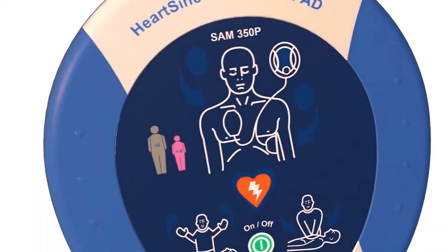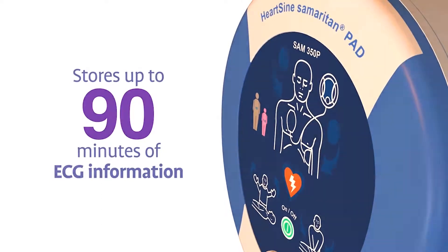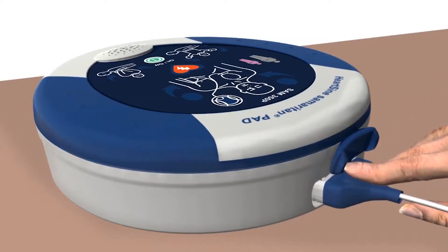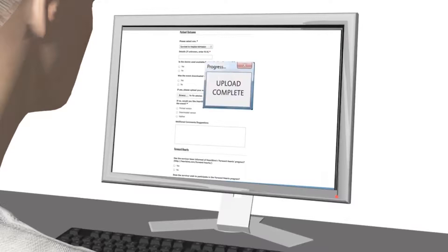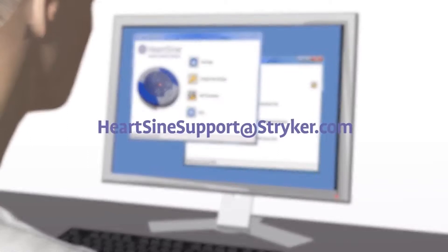The Samaritan PAD stores up to 90 minutes of ECG information after use. Use the SAVER EVO software, which can be downloaded from the HeartSine website, and the custom USB data cable to download the event data for a physician who may want the information to help inform treatment decisions. After using the Samaritan PAD during a sudden cardiac arrest, submit the SAVER EVO file and a completed customer event form to HeartSine, and HeartSine will send you a free replacement pad pack. After downloading the event data, please erase the data from memory.